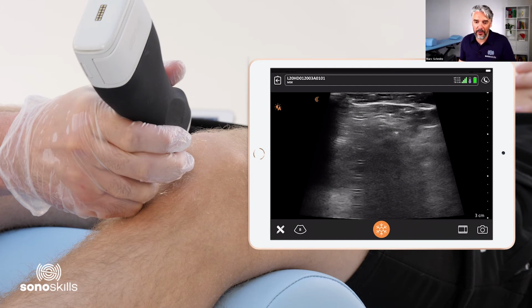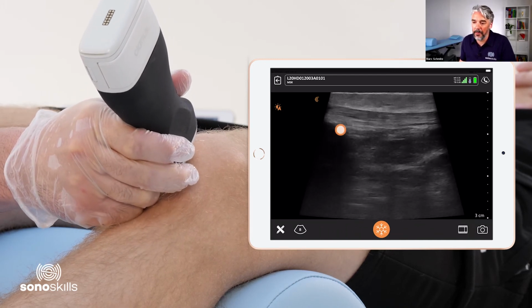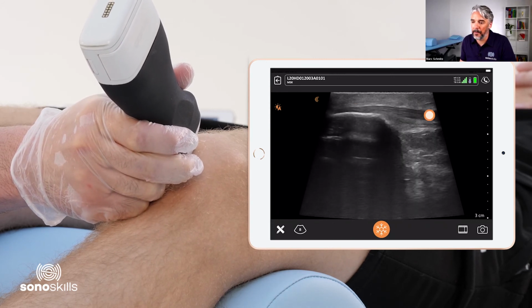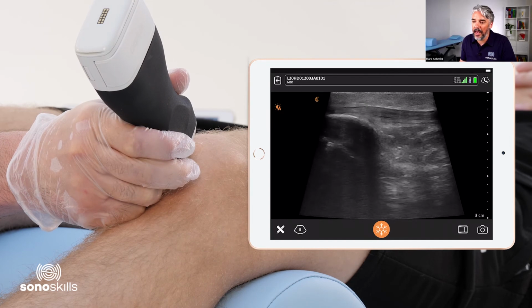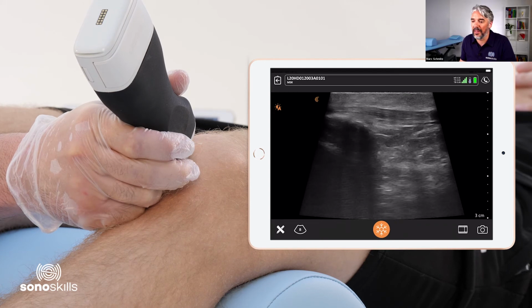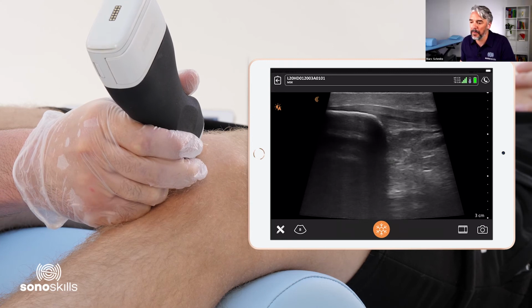So let's look at this last demo of this talk and place the transducer first in longitudinal view over the patellar tendon, connecting the patellar bone right there. And we can see the patellar tendon right there. I'm going to scan from medial to lateral to scan every part of the tendon. And if I've done that, I'm going to scan from proximal to distal to follow the tendon all the way to its insertion at the tibial tuberosity.